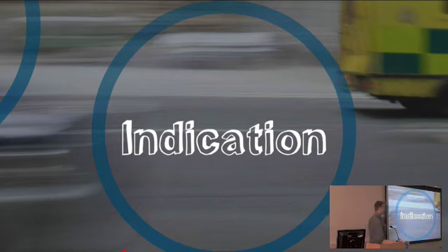Then I talk about the indication. Now, you might not have that information in an OSCE all of the time, but it's very useful to know the indication. I would never look at an ECG without finding out why it's being recorded, because that really is going to influence how you interpret it. If you're looking at the ECG of somebody with acute chest pain, you're going to be thinking of diagnoses that are very different to somebody who might have gone to their GP for a routine appointment and be having a routine screening ECG, for example.